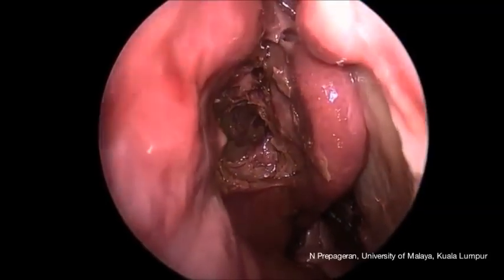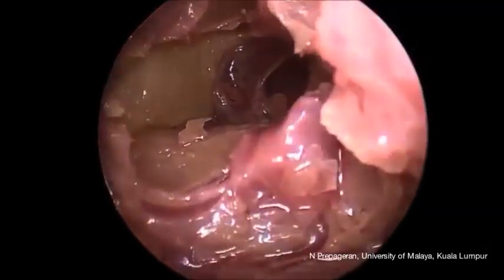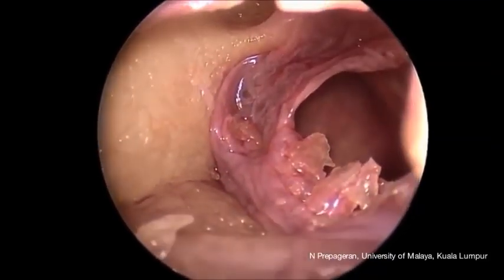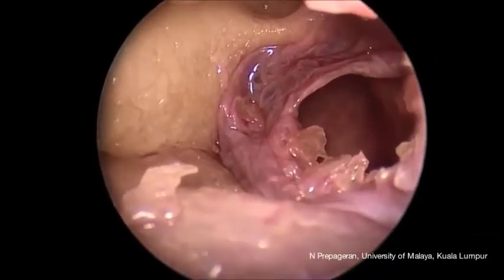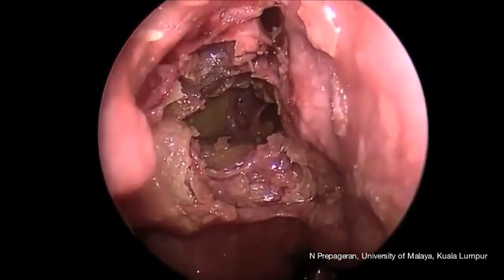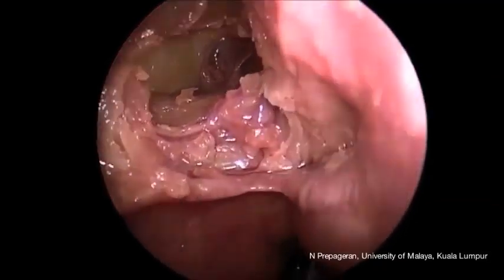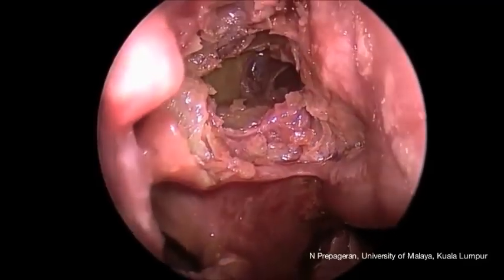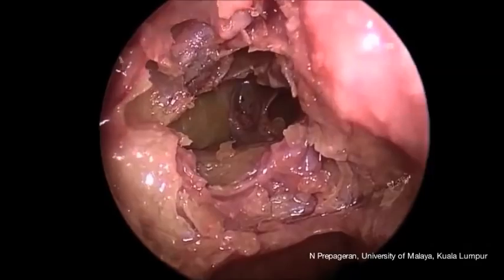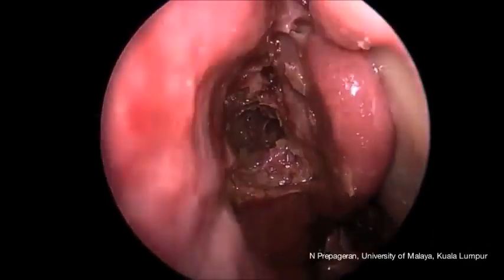Now, I'm going to continue to remove the remaining parts of the ground lamella, and then there's a very nice view of the posterior ethmoidal artery, as you can see just up there, which is just in front of the anterior wall of the sphenoid, which is gate number 4. The maxillary ostia is beneath the bulla, as you can see, which has been removed, and the ground lamella has been removed as well.